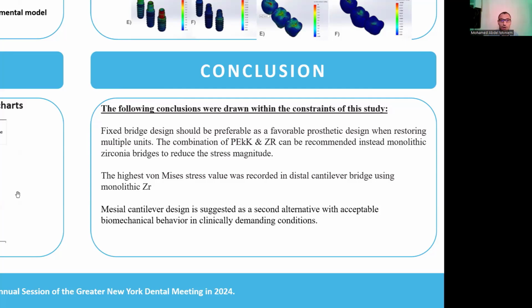The second conclusion is we should avoid distal cantilever because the highest von Mises stress values were recorded in the distal cantilever bridge using monolithic zirconia.